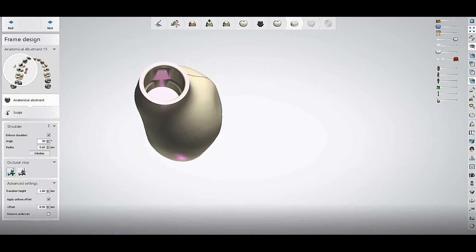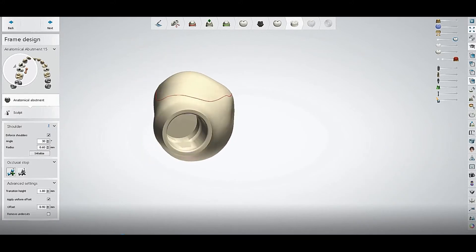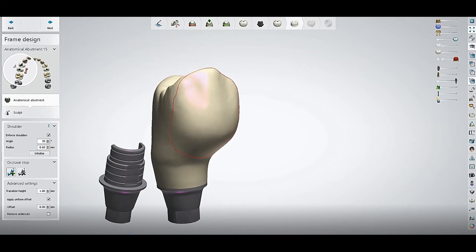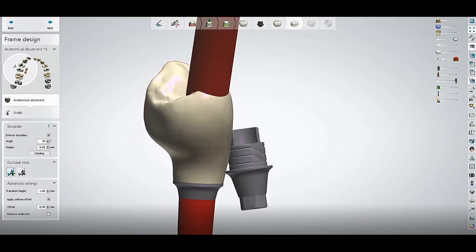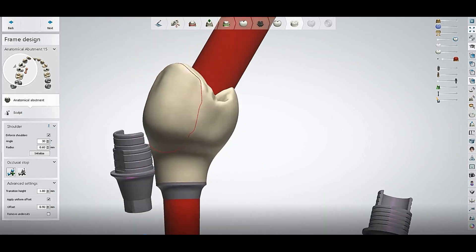First we will see if there is any problem with the crown. Check the thickness and if there are any thickness issues, ensuring everything is okay.